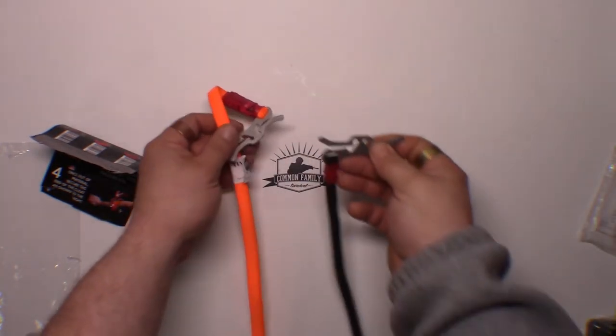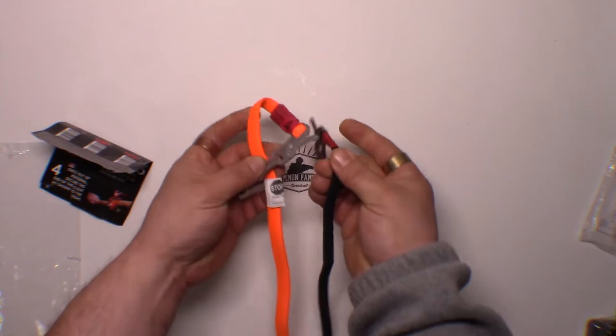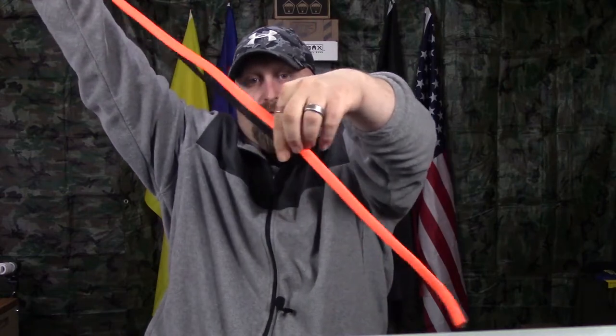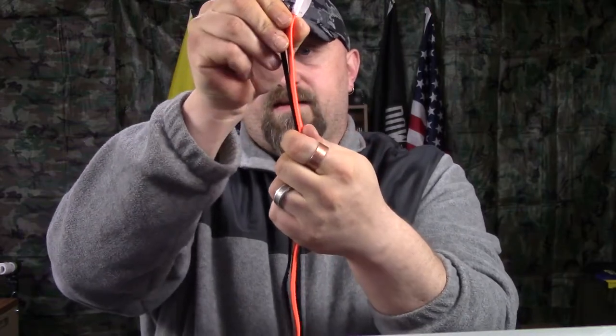There is a major difference in these tourniquets. Here's just to show you the difference in the length - the fake stops there and the real one keeps going. You've got an extra whole other foot on the real one. This is a very sturdy core - you're really going to get some tension on that and really be able to pull on it.